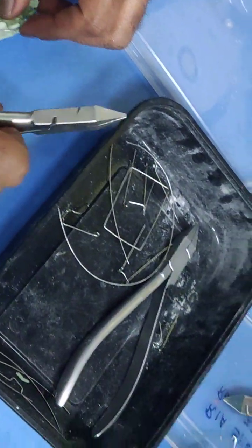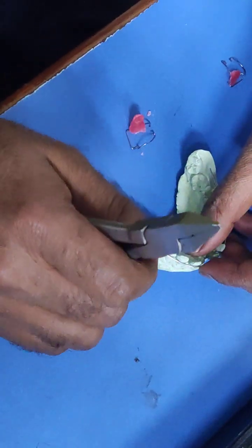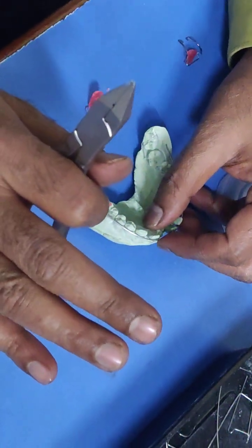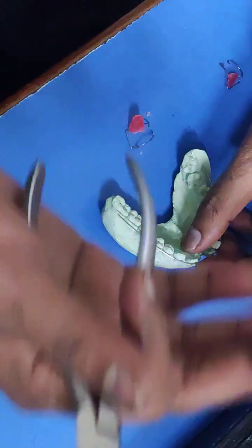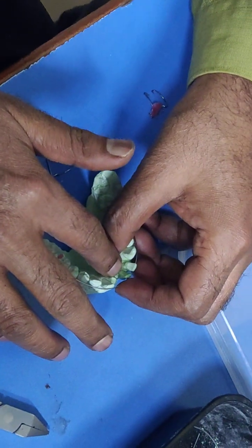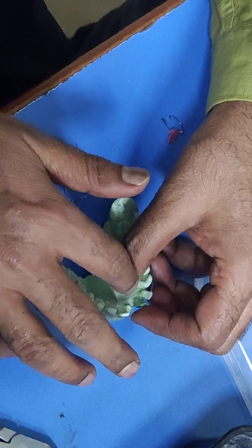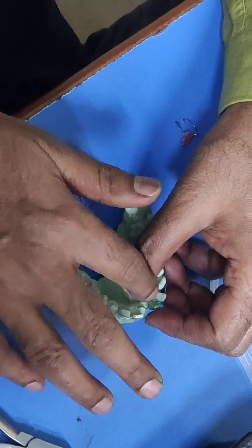Now for fabrication of the U-loop, you hold it as the mesiodistal width of all mandibular teeth except molar. They are relatively smaller compared to upper incisor, canine and premolar. Here spacing is found approximately 8 to 9 millimeter in the anterior region.